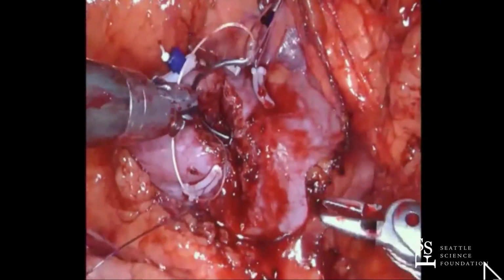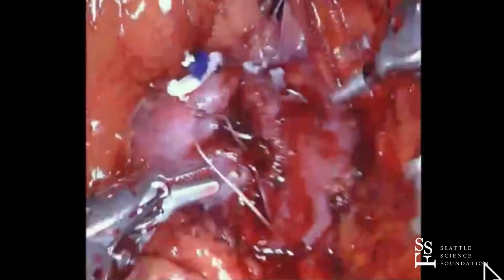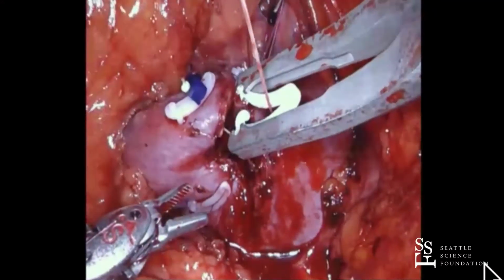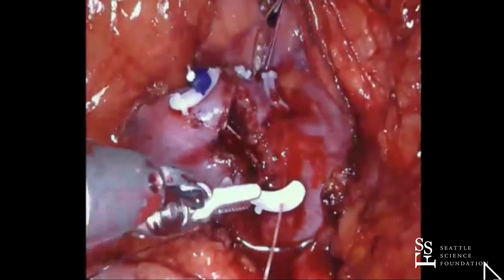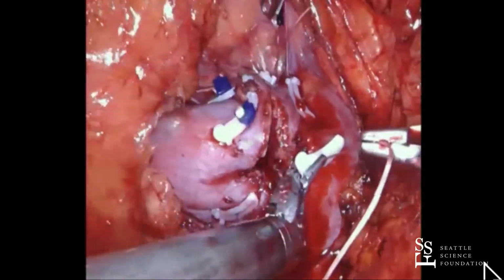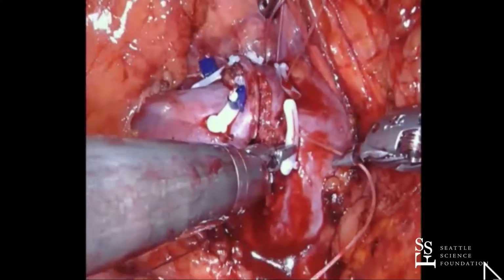For Ronnie's technique, where it's kind of open at the end, it doesn't matter. Then you can do whatever you want. But if you're going to close it like this, I put a little sliver in there. The problem is if you put too much, it overflows and then it obscures everything. So really just a little teeny tiny bit.